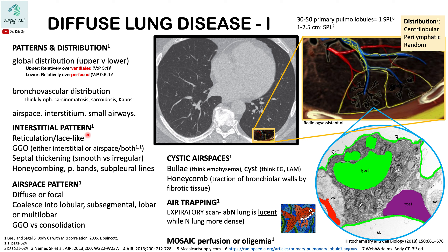We're going to talk about the diffuse lung diseases. A nice approach to reading chest CT is to first take a bird's eye view at the pattern or distribution of the lesions — look at where the lesions are predominant. Is it upper or lower? Certain diseases prefer the upper lung zones while others develop in the lower lung zones.